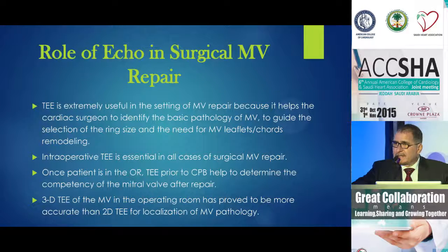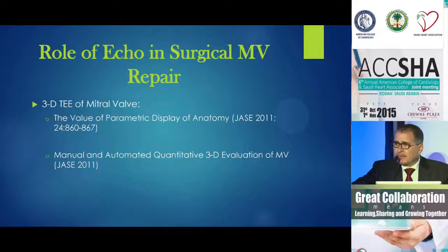I have to admit that till now, although we do have the 3D TEE probe, we are not doing it routinely on our mitral valve repair cases, and this is, I think, a major deficiency from our side, the echocardiologist side, which I think is going to be a major help to our surgeons to improve results when it comes to mitral valve repair in general.